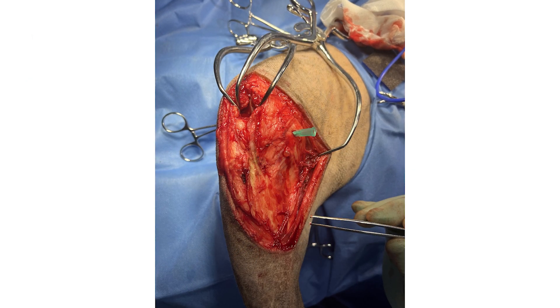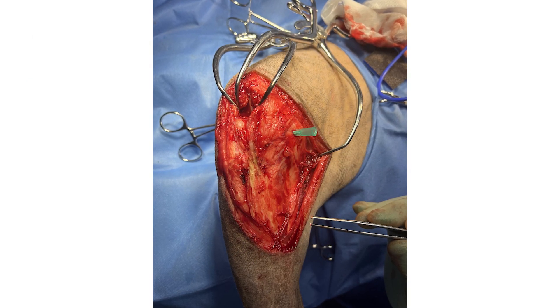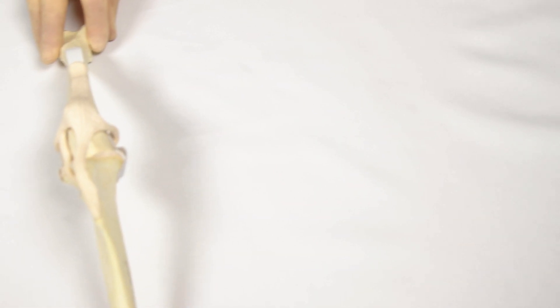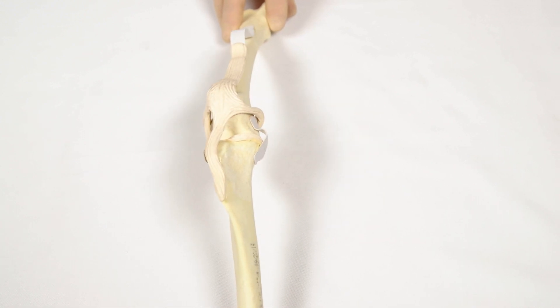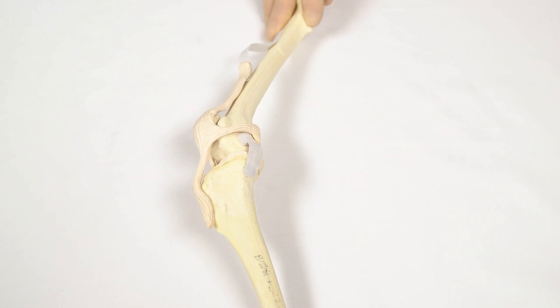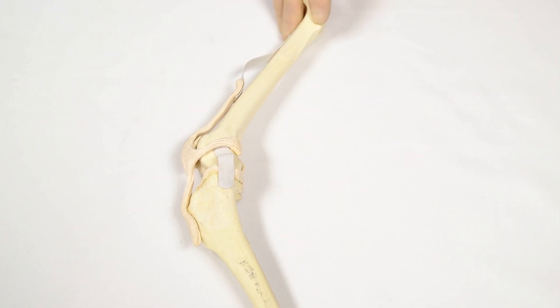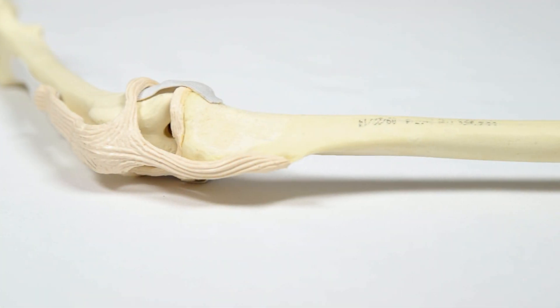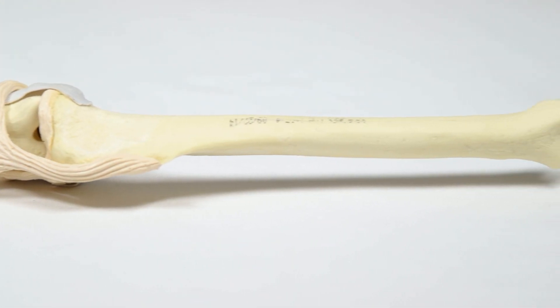The soft tissues are elevated to expose and access the proximal medial tibia. More experienced surgeons may choose to keep the patient in dorsal recumbency, but lateral recumbency with the affected limb downward is recommended for beginners. The tibia must be parallel to the table.